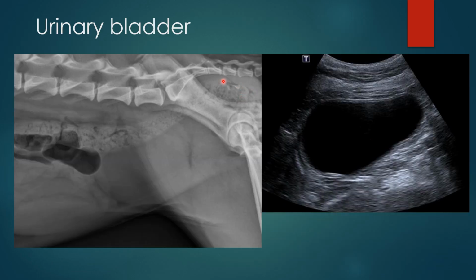All right, last but not least, let's talk about the urinary bladder. The urinary bladder is found in the caudal abdomen, obviously. If you're having a hard time finding it in a live animal, go to the pubis. Put your probe way back here till you hit bone, and maybe go in a transverse plane. If you're imaging in a transverse plane, you're slicing the animal from right to left, so you should not miss it. Then start to slide cranially, and you should hit the urinary bladder.